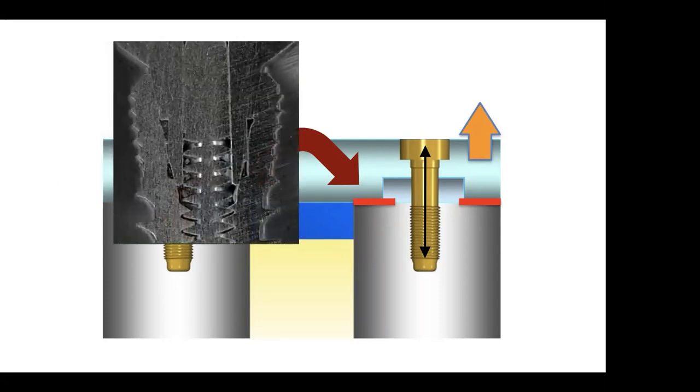When you look inside the implant, this is how it looks. The upper parts of the abutment screw engaged into the lower part of the internal threads. Can you see that in the red, yellow square? The upper part of the abutment screw is in contact with the lower part of the internal threads. Because the thread is stretched out, it's pulling up the implant or pulling down the prosthesis.